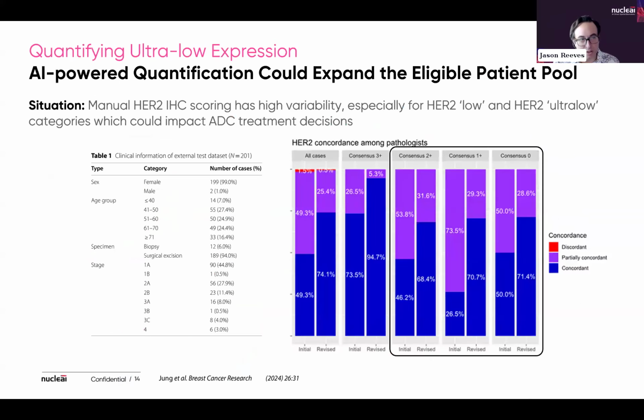So in the first case, when we're talking about HER2 staining, one thing that I think is important to baseline everything off of is the way in which pathologists are traditionally trained to score certain stains. HER2's been around for a long time, and HER2 positive patient samples have traditionally been from very high expressing HER2 cases.